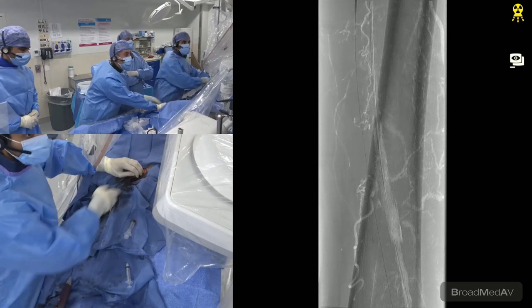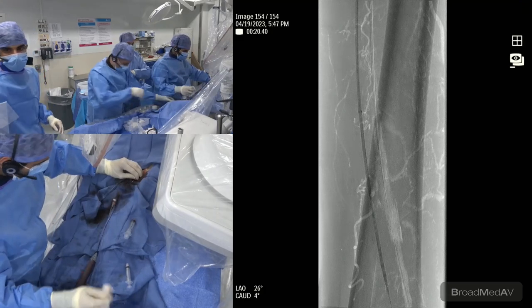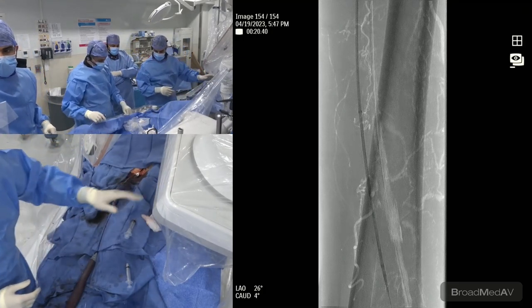Keep coming. He has obviously moved. We're going to have to do another smart mask. That's okay, I got it. Yep, go. So here comes the Supera. It's going to look long. Okay, right there. Stop there.